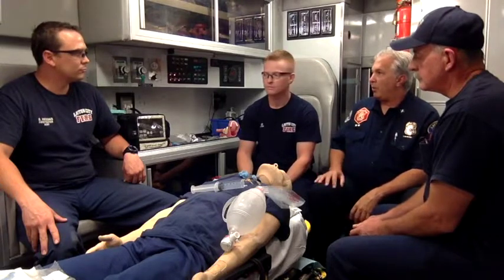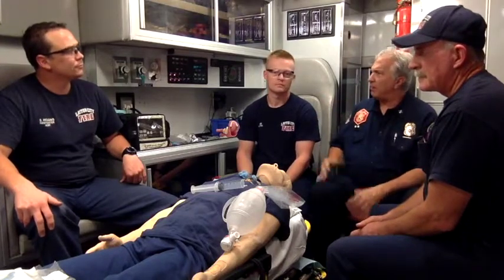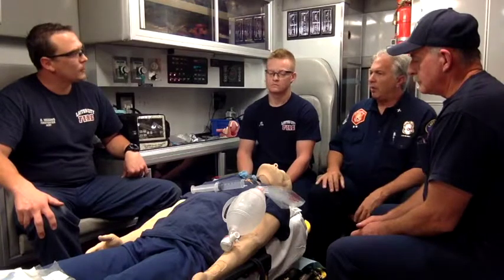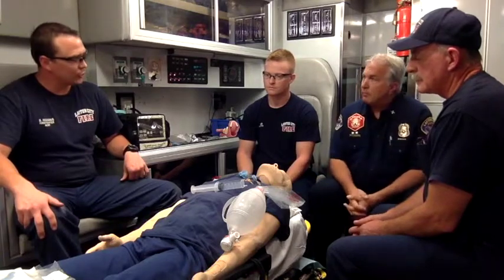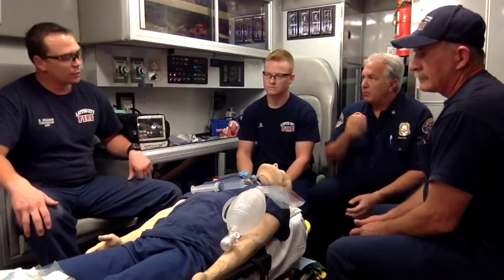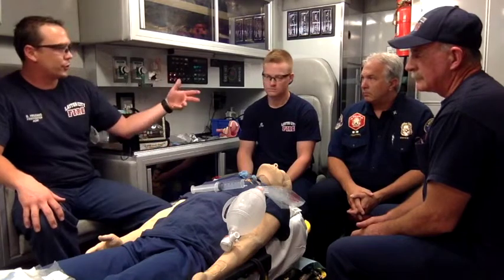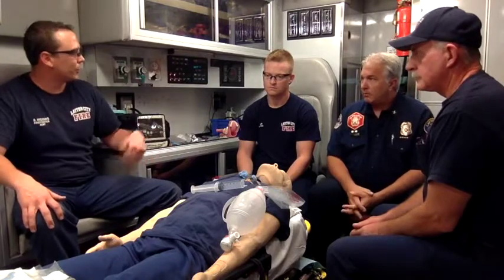But I remember that before we bought these new bags, we had that funny pouch on the side, because a bunch of the guys had gone to the airway class and thought it was really important. And I agreed that it was important that we have those King Airways, but they kind of went away. Is there some in the bags? Occasionally I find them in there. The general consensus was to improve the longevity of the bag by reducing what was in it. And no more 10-pound bag? Exactly. We figured the Kings have their places, and we can use them along with the suction. We'll probably need the suction if we need the King, so we can put it in its own bag next to the suction, and when we grab that, we can grab the Kings.